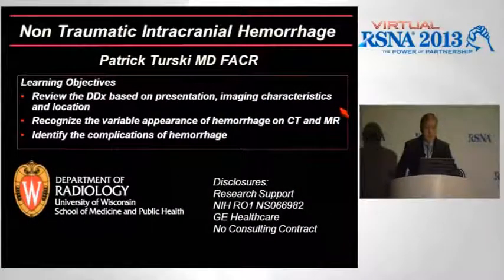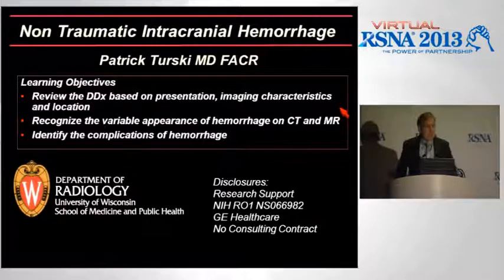Thank you very much, Howard. My goals today are to review the differential diagnosis of intracranial hemorrhage based on its presentation, imaging characteristics, and location, to recognize the variable appearance of hemorrhage on both CT and MR, and to identify the complications of hemorrhage.